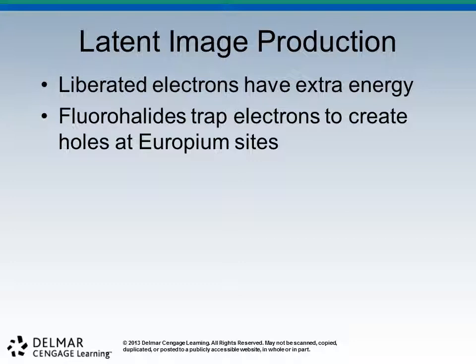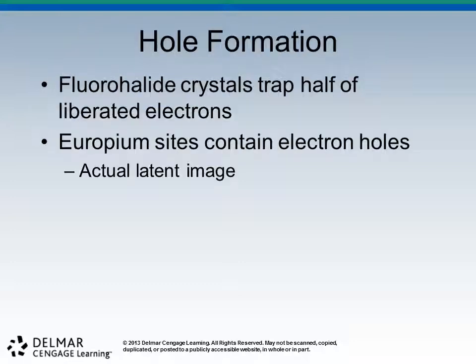They trap those electrons and hold them at these europium sites. Remember, it's europium activated barium fluorohalide. Don't get, oh my God, this is terrible. No. Electrons are created and they're absorbed, and they're held there in the lattice work until we're ready to release them. Then that'll help us create the image. So they fall into these holes. We call them electron holes. Your book discusses that a little bit. These electrons are created and fall into traps or holes.